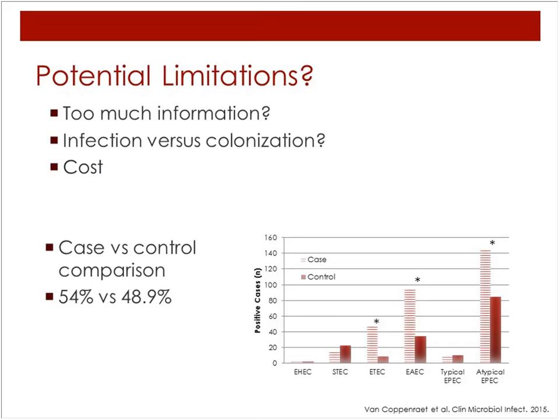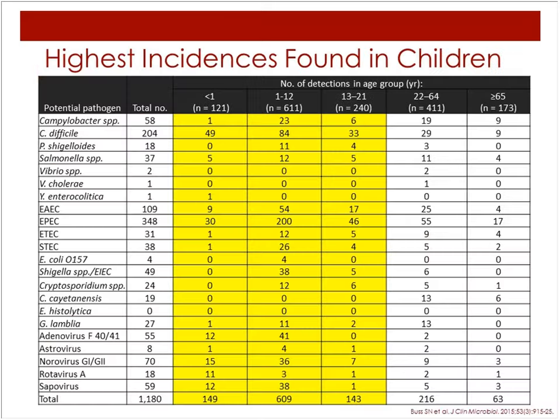So this again reiterates the need for judicious testing in relevant patients only. And this really applies for every single lab test that we do. You shouldn't be screening for bacterial pharyngitis in patients presenting with a cough, and you shouldn't be testing on a GI panel for patients in the absence of actual GI symptoms.